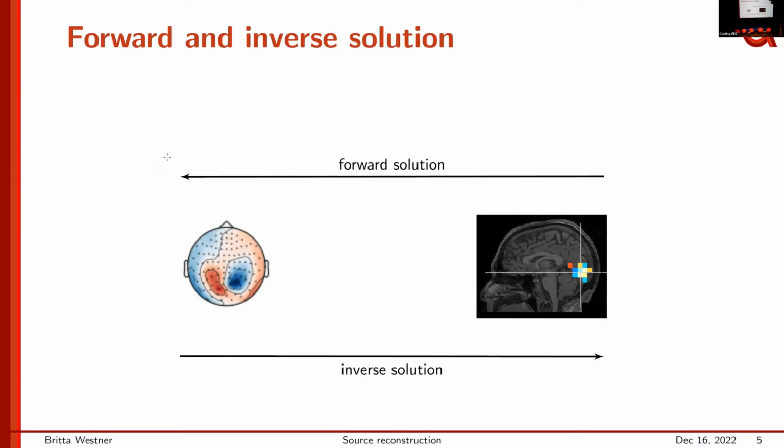You measure something that originates in source space, but you measure it out at the sensor level. But it's also something that we will need to simulate to make our inverse solution. So it's a first step that we actually go the other way that we intend to go later, to then be able to actually estimate the inverse solution. And the inverse solution is nothing else than our source reconstruction, our source localization, our source model.